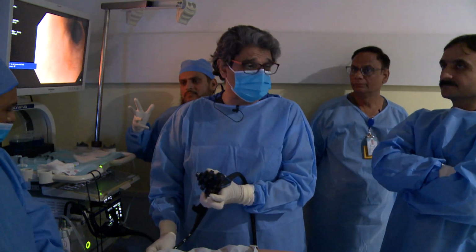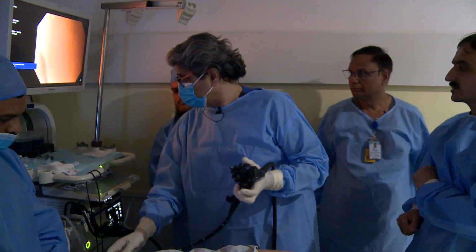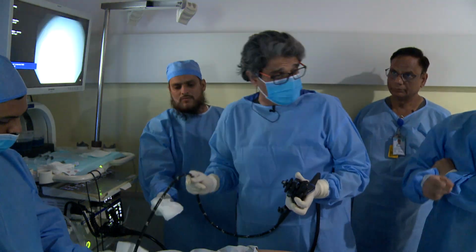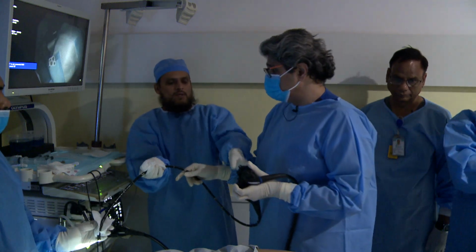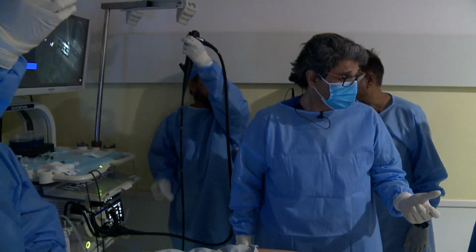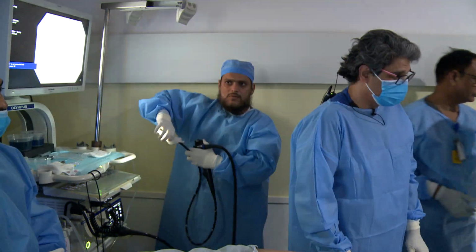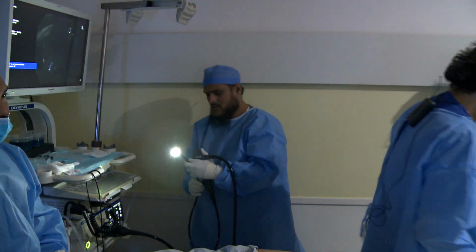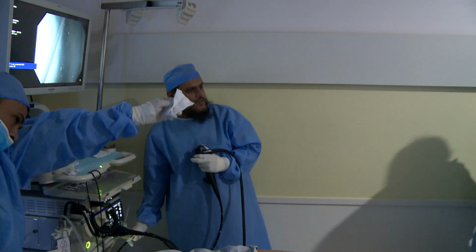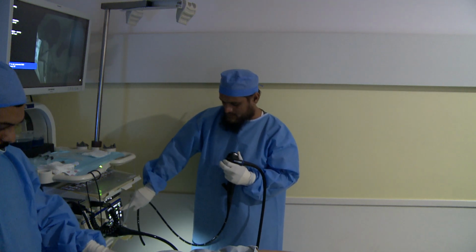We're hopeful the margins are clear. Let me show you the lesion. One of the ways we do that is you can throw some methylene blue on it. Where is that lesion? Lovely. That's fine. I think the wide rim around this, I think it's all clear.